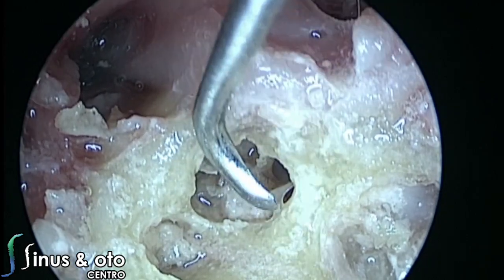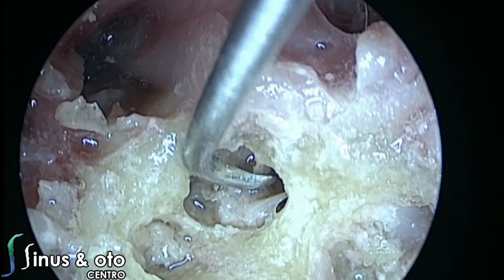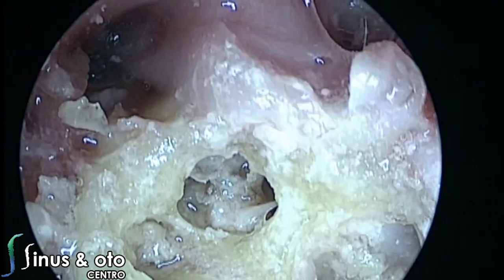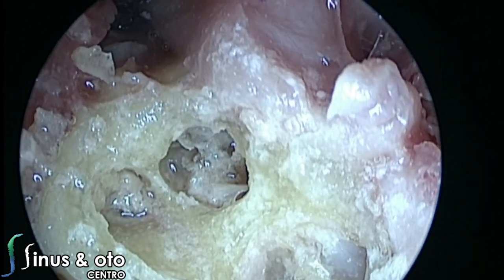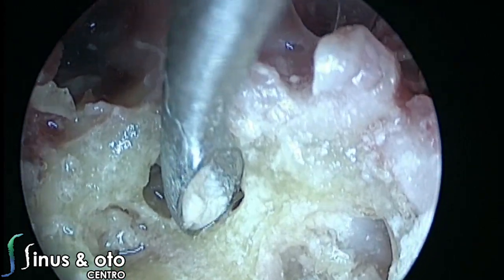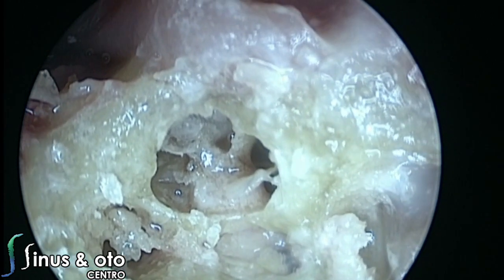This is the region of the fundus of the internal auditory canal. So we need to open this region in order to see the internal auditory canal, and the cranial nerves that are inside it. We can open with several instruments: ultrasonic aspirator, piezo surgery, drill, or curette, of course. This is a dissection, so we use the curette, and once we use the curette, we already open the fundus of the internal auditory canal.